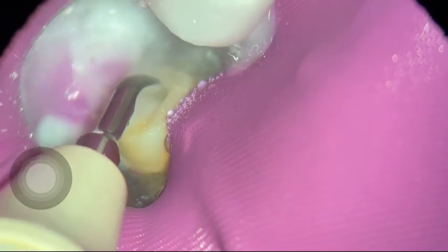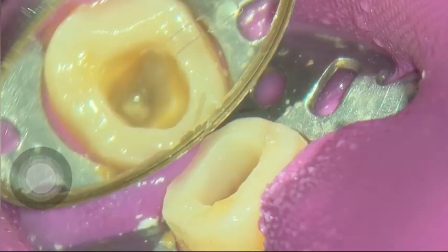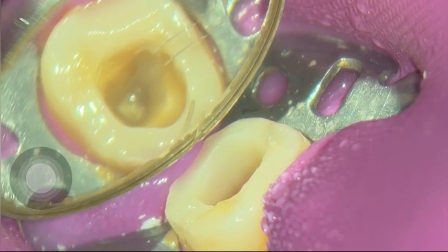As you can see here, I'm going in with my ultrasonics. The temporary filling just pops out very, very easily. I remove the cotton ball and there is my prepared access cavity. In this case, as I said, two canals.